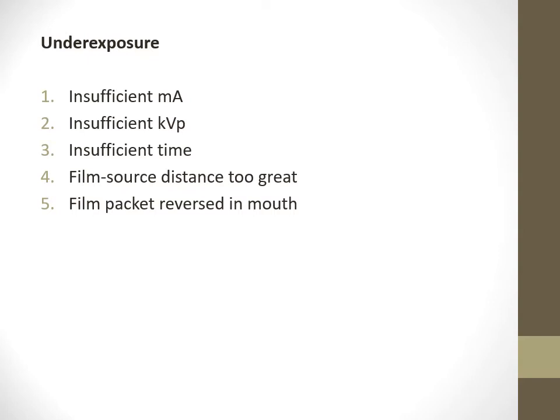If you come across a light radiograph, you should be able to say what the reason is. Is it due to underexposure or due to underprocessing?